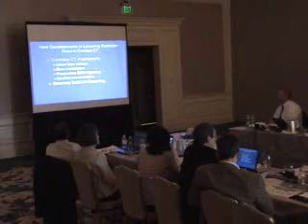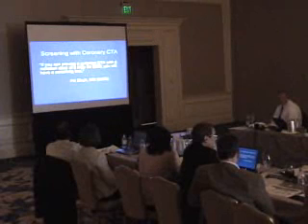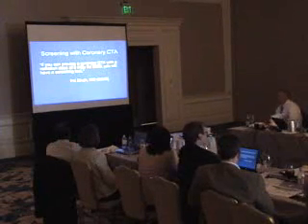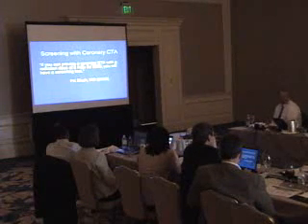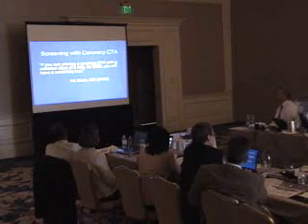So I'm going to talk about CT coronary angiography a little bit, and then about coronary calcium scanning, and make this short. A few years ago, PK said, if you can provide a coronary CTA with a radiation dose of 2 millisieverts for $500, you'll have a screening test. It is a very effective test for looking at cardiac risk, and it may be that we're approaching these levels.